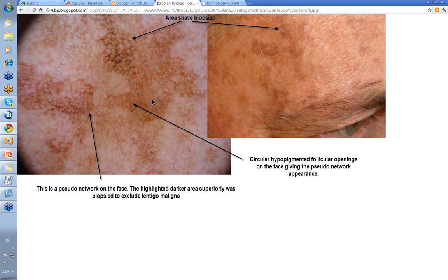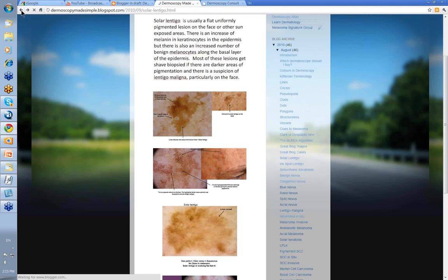There was an increase in the number of melanocytes but the melanocytes themselves weren't atypical, and there was no extension down the hair follicles. If you get extension of abnormal cells down the hair follicles, that's really one of the things you look for in a lentigo maligna. This was the pseudo-network in the face, and this was the bit that was shave biopsied to exclude lentigo maligna. Don't punch these — please take the whole thing with a shave or do an excisional biopsy.